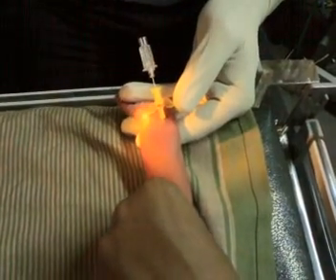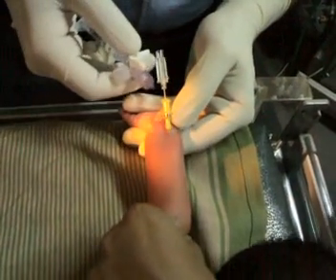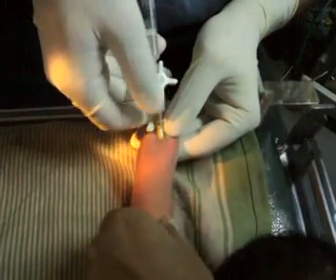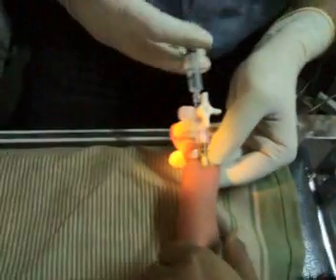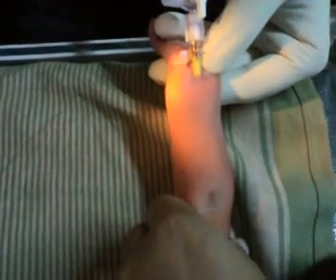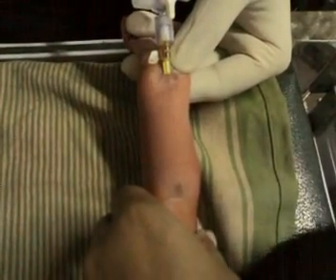Give me that syringe, remove the tick — one of you can please remove it. You can see that after flushing this — lights off please — after flushing, there is blanching in there, and then you get the cannula in the artery.